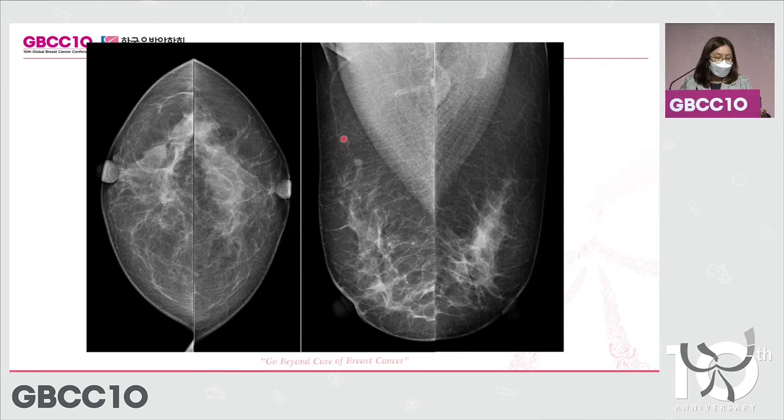And we can see a lump here. But for inexperienced doctors, since this is a very small lump of 3 millimeters, sometimes you might miss this. If this was very visible on both sides of the view, it's very hard for you to miss this. Because here, this lump did not include the deeper part of the breast on the image. So we talked about the importance of length.